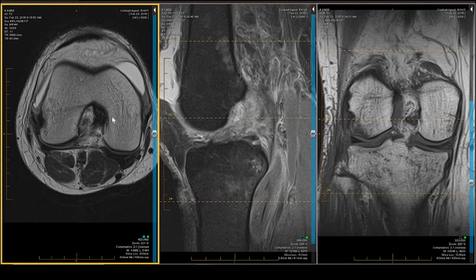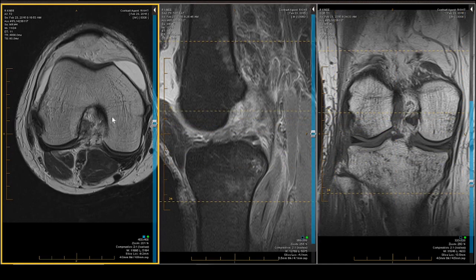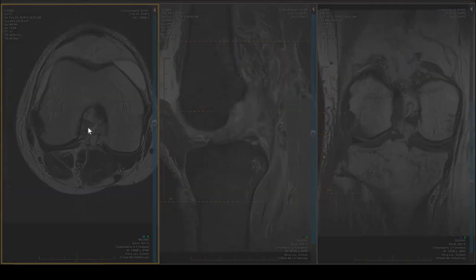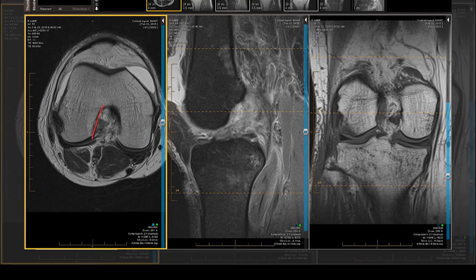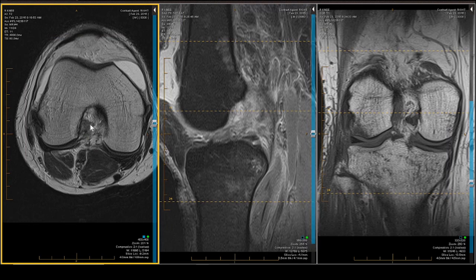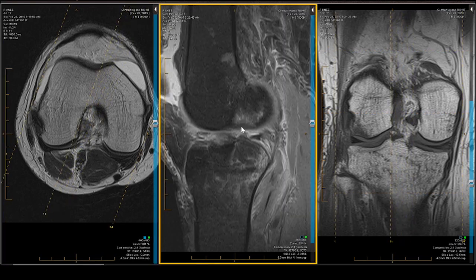We could also see it in the axial projection. We got a lot of information from the axial — paired fractures in the back should lead us to conclude there's been a serious shift of the femur relative to the tibia. The ACL, which should be a linear straight structure, is just a big gray blob — it almost looks like a PCL, it's so round. It is totally fibrillated, totally pulverized, consistent with a violent pivot shift with rotation.